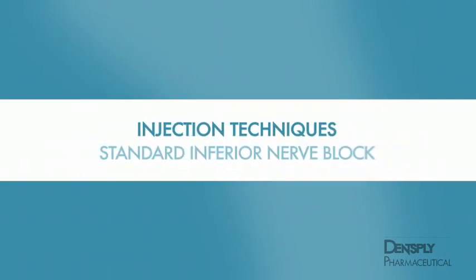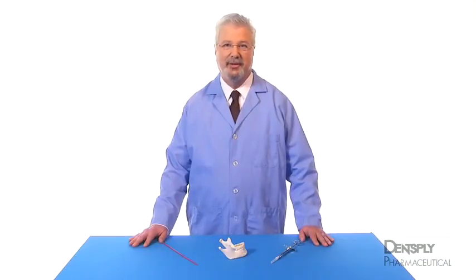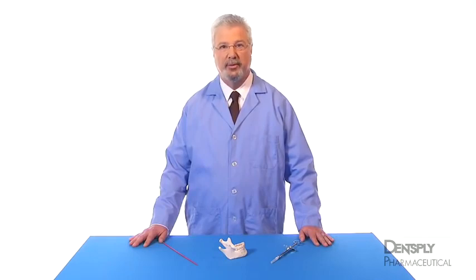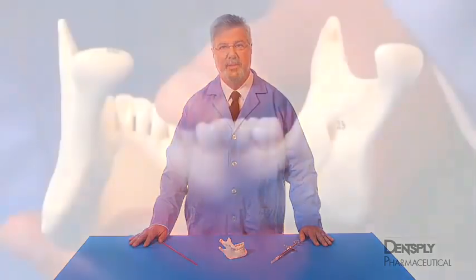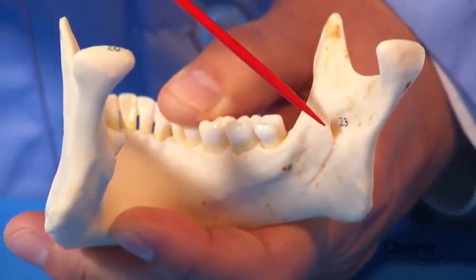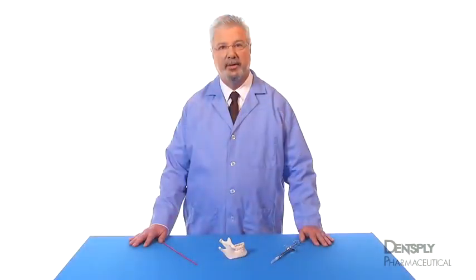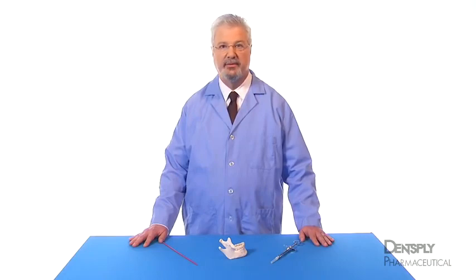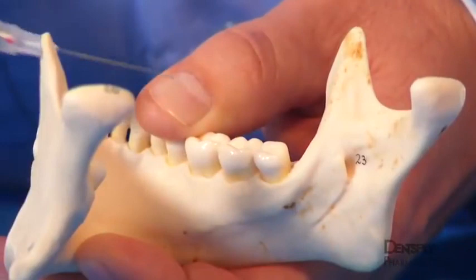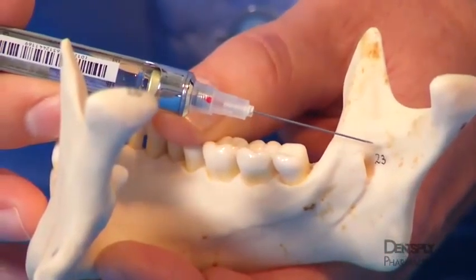Injection Techniques, Part 1. A standard or classical inferior alveolar nerve block is used worldwide for producing mandibular anesthesia. The target for the inferior alveolar nerve block is the mandibular sulcus, just superior to the mandibular foramen and behind the lingula, a bony prominence on the ramus that anchors the anterior attachment of the sphenomandibular ligament. Deposition of anesthetic in this region will bathe the inferior alveolar nerve just before it enters the mandibular foramen.